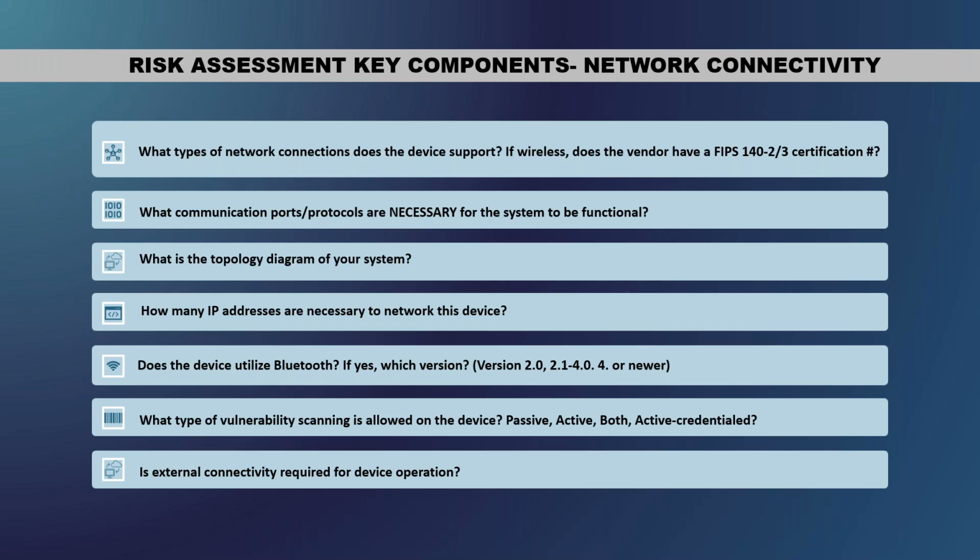Bluetooth is coming up a lot more. What people need to understand is that there are some security risks with Bluetooth. One time I saw a medical device where they said, yeah, I can connect to any phone. And I asked, is there an authentication before someone is able to access the information on the medical system? And they said, no, that's the whole point, the ease of use. Well, there's a security risk, right? So that's when I started saying, okay, we need something to verify that we have permission to access before you implement Bluetooth.